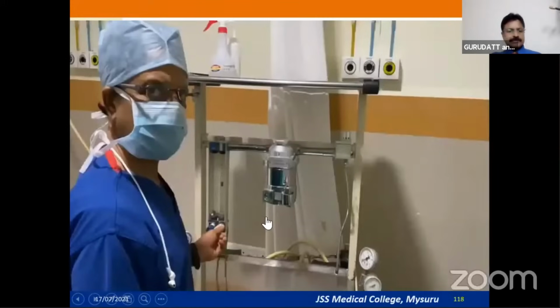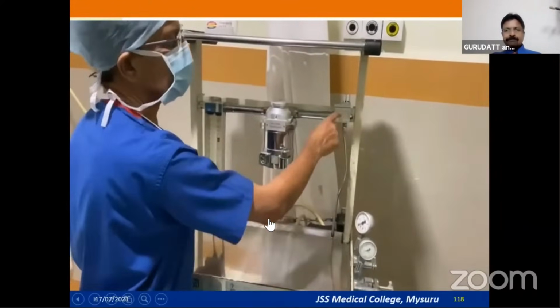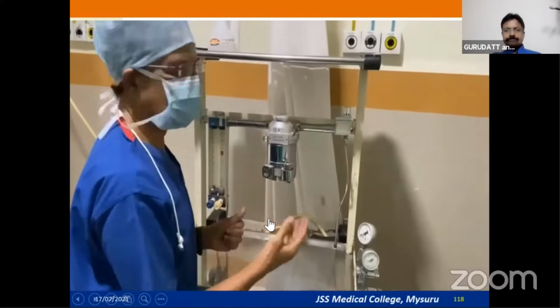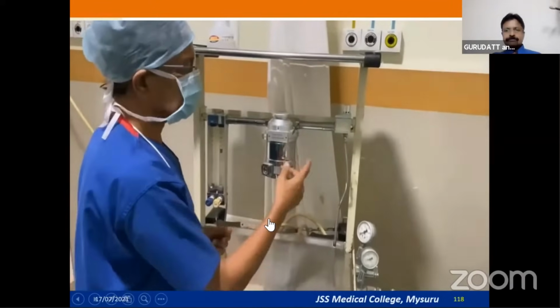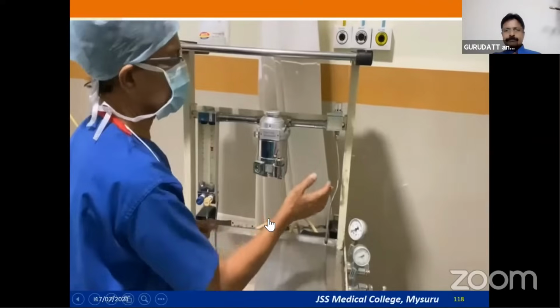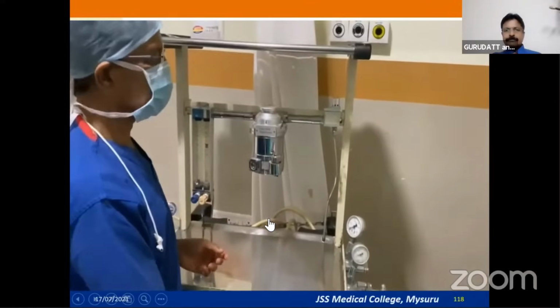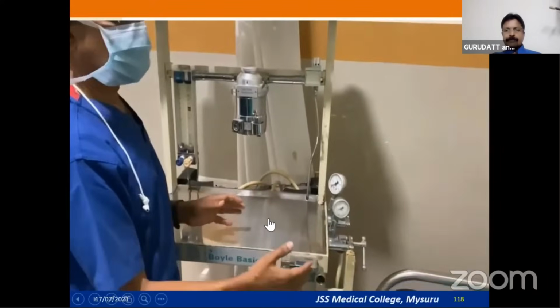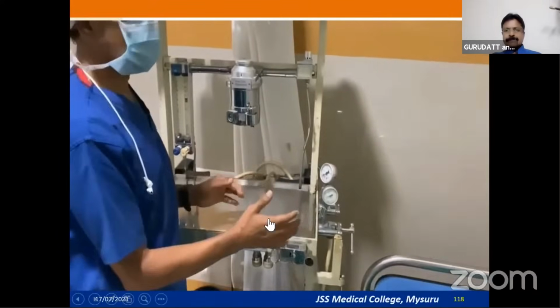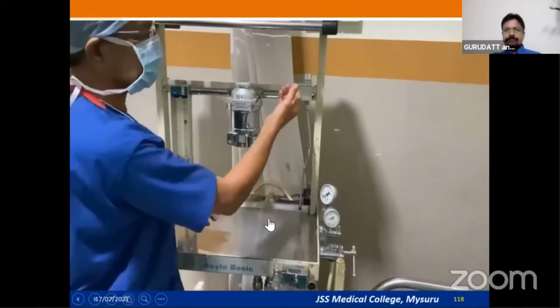So this is just a small video. Now you see, this is the pop-off valve and also a check valve. Both are there in Boyle's basic machine. I'll just show you. So when I block here, whenever the back pressure goes, now I've opened up oxygen. So I'll close the common gas outlet, and at a pressure of about 300 centimeters once it develops, the pop-off valve will open and you can see the gases going out.